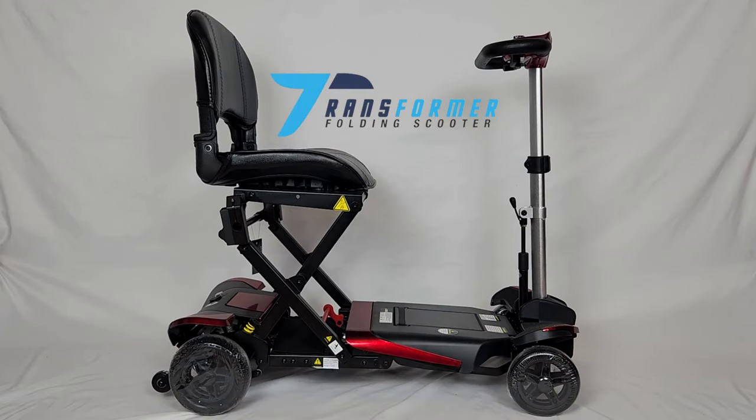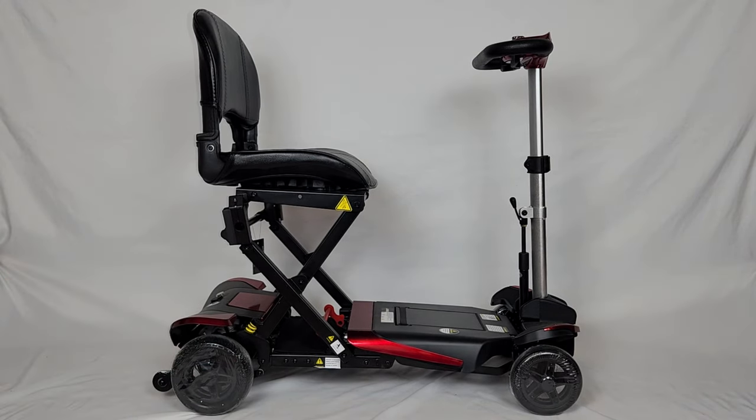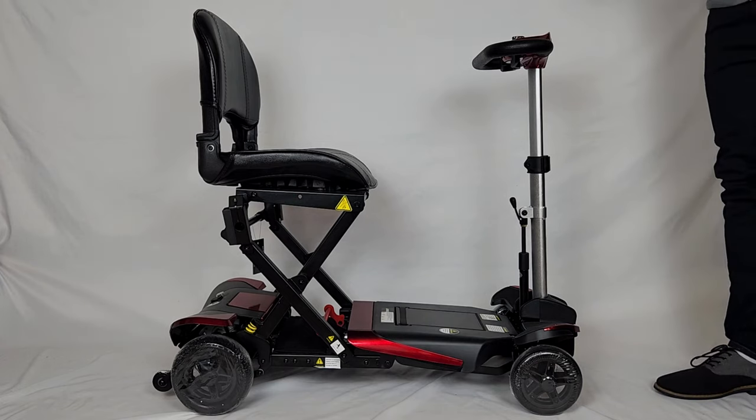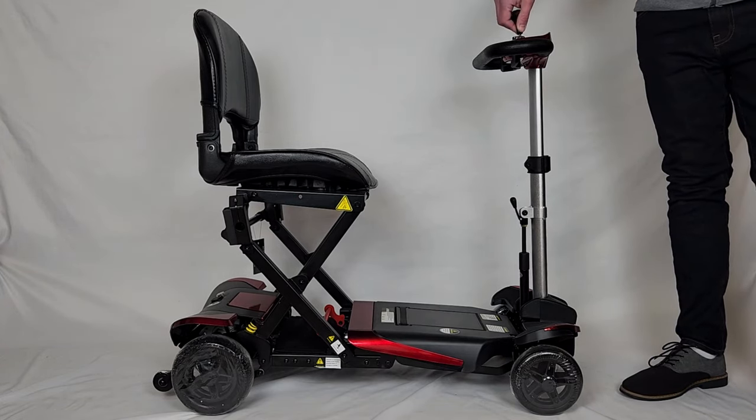Now I'm going to show you how we fold up the Transformer scooter just with the touch of a button on your scooter's key fob. In order to fold your Transformer scooter with that key fob, first you're going to put your key into the ignition and turn it on.